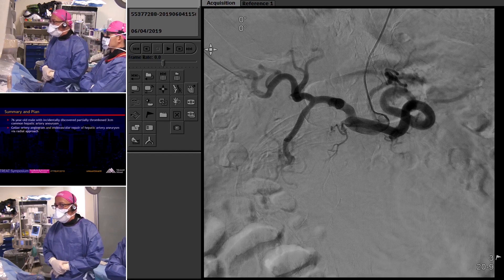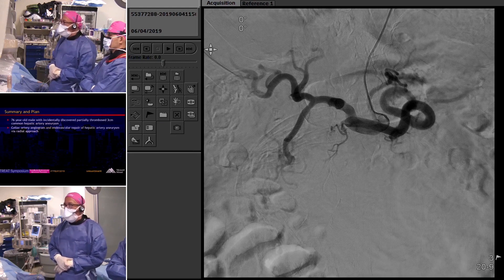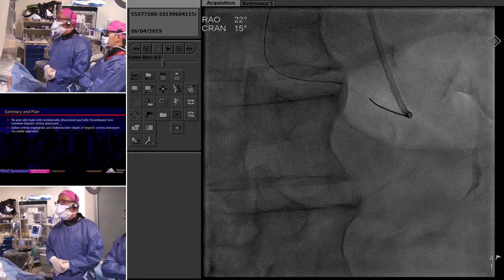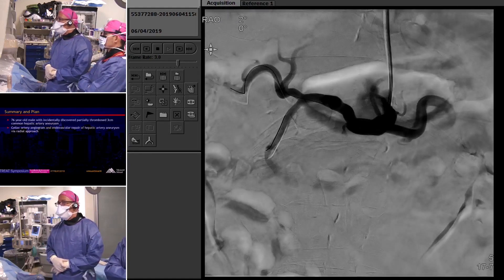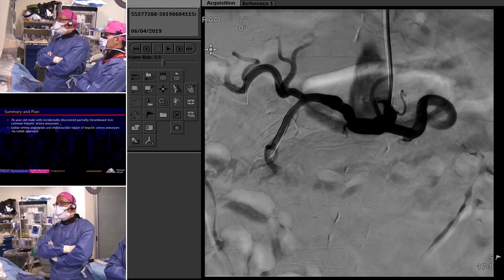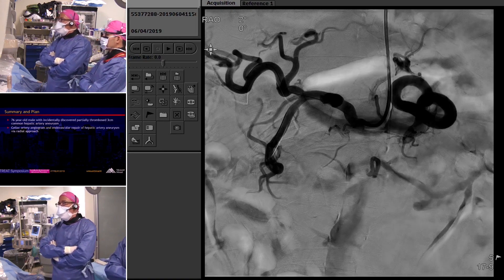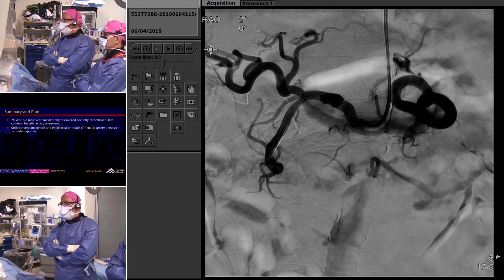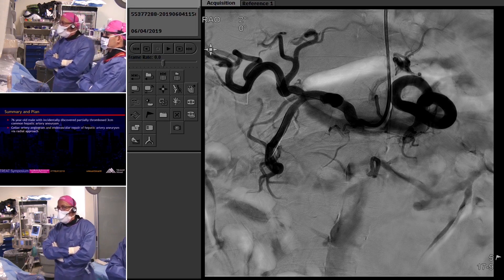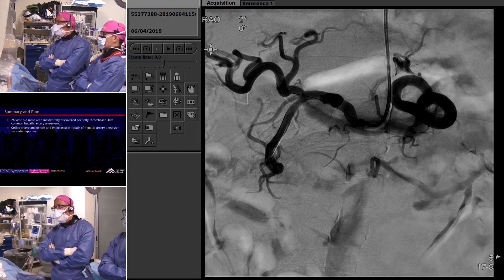For the working setup, we put in a six French slender sheath and traded out the Sierra catheter over an exchange length wire positioned in the splenic artery for a six French JR4 guide catheter. We have a buddy wire in the right hepatic artery — a Fathom wire as we'd normally use for celiac artery interventions. In the gastroduodenal artery, we have a coronary support wire, specifically a Stabilizer wire manufactured by Cordis, which I personally like for introducing visceral artery stents.